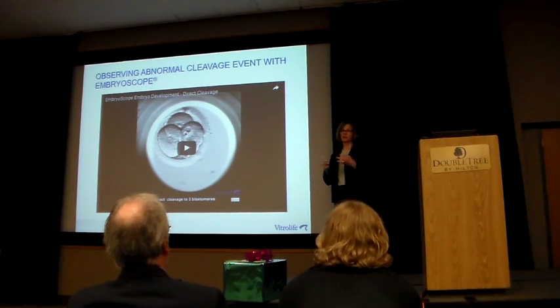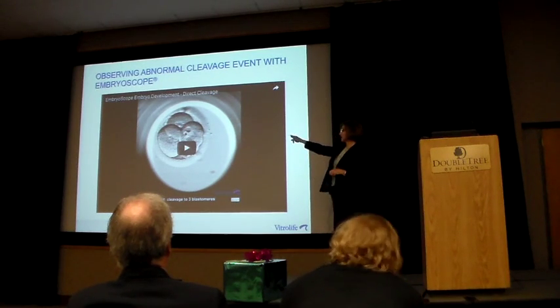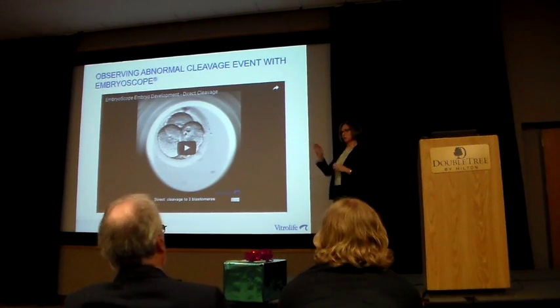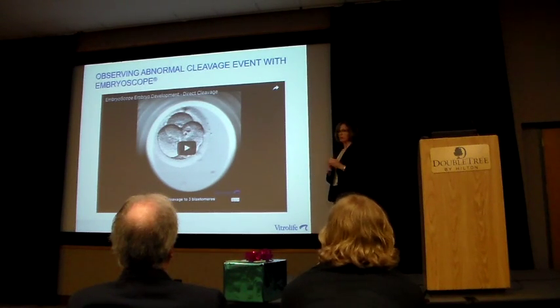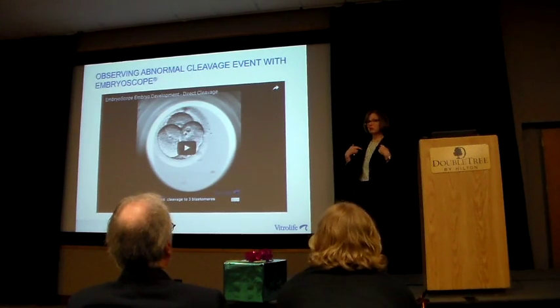Like Erin was talking about with the PGS testing, you can determine when the chromosomes aren't right, even if it's a beautiful blastocyst. Well, a beautiful blastocyst can also do some really funky things between point A and the end point. And one of the things that it can do is it goes from that real pretty one cell that I showed you in the others directly to a 3 cell. There's no 2 in between. It goes from 1 right to 3. This is really easy to see when you're watching these videos. This event actually occurs sometime in the middle of the night, and I don't know too many embryologists anymore that come in and look at embryos in the middle of the night.